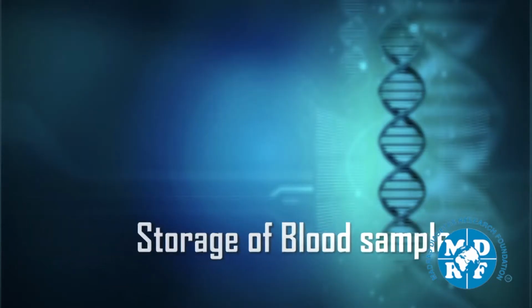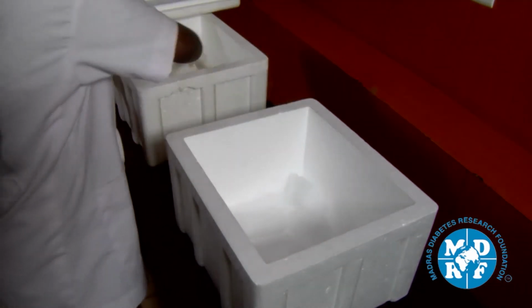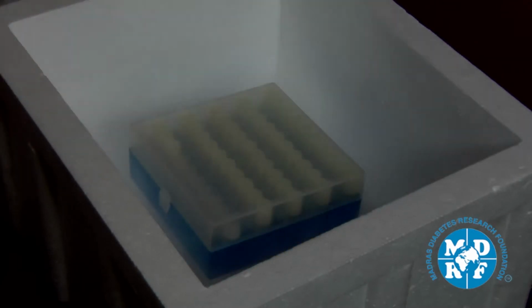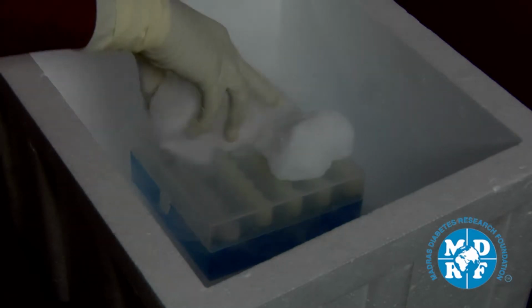Storage of blood samples. The next step is to ensure that the samples are preserved in the appropriate condition till they reach the lab for analysis. Following centrifugation and aliquoting, the samples are placed in the field ice box until they are transferred to a refrigerator prior to transport to the central laboratory.